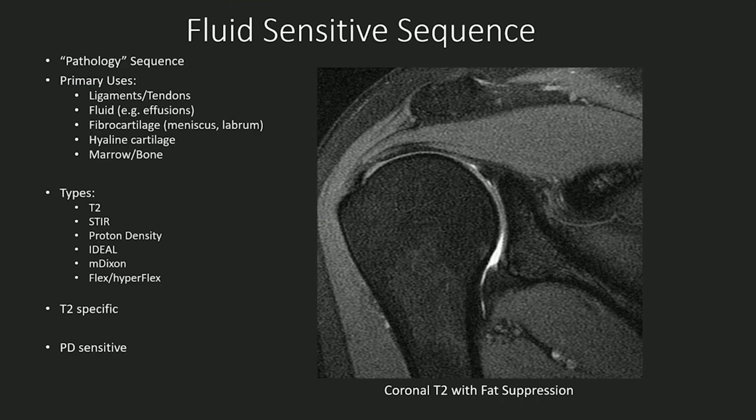And that bright signal is typically a tear. If a tear occurs in meniscal tissue, the tear occurs in a joint, and a joint has joint fluid. That fluid often will extend into the tear itself or dissect into the tear, and that's why we see that bright signal within a tear. In terms of criteria, it's also important to realize what counts as a tear and what does not count as a tear.